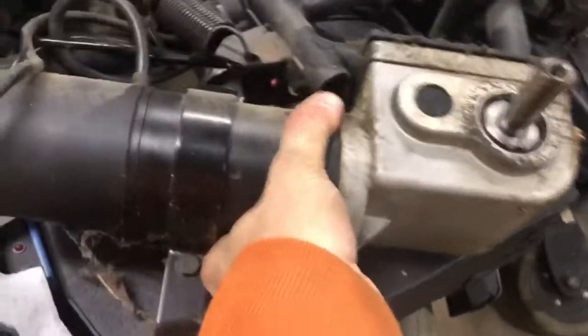Let me see. So you will have to remove this. Let's see. Somebody has really cut this one short. I usually see them really long. Hopefully the one in your chair is longer than this one, because this is going to be a headache. So what I'm going to do is I'm actually going to put the chair on the side.